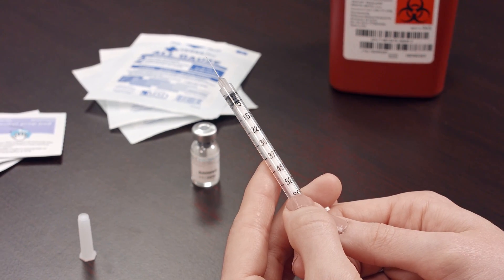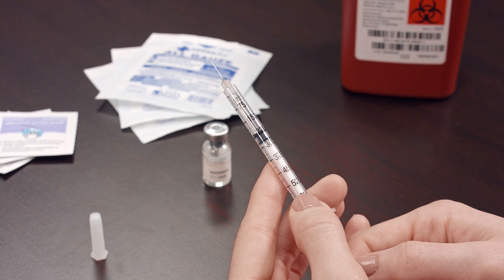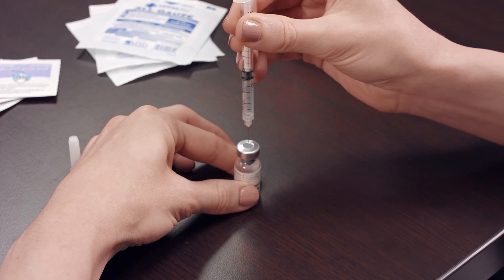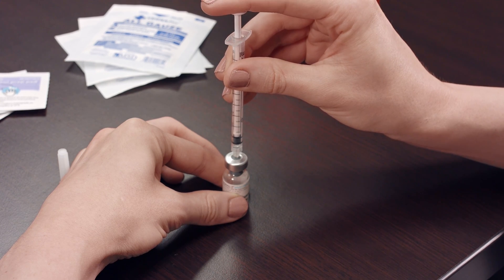Hold the syringe upright and draw in the same amount of air as the dosage required — for example, 225 units. Insert the needle into the Gonal-F multi-dose vial and push the plunger until all of the air is inside the vial.